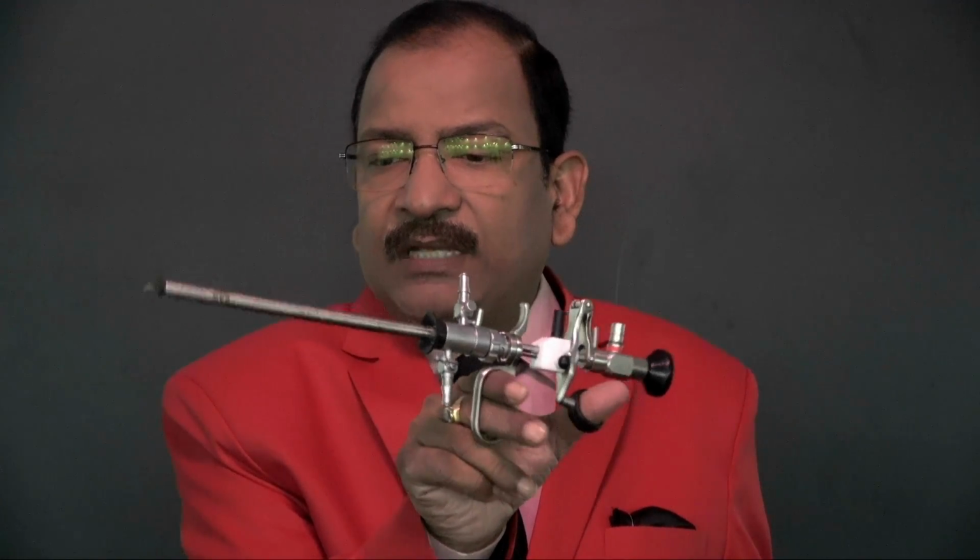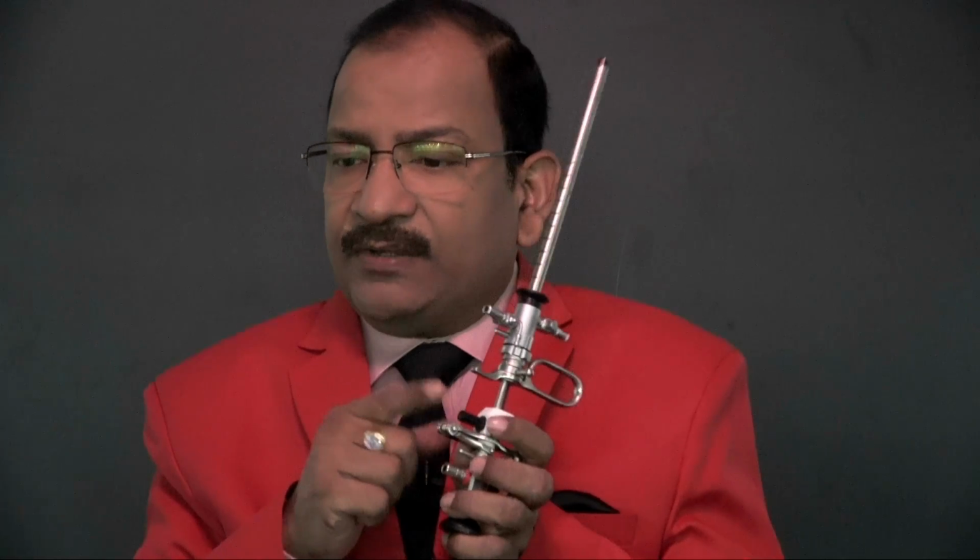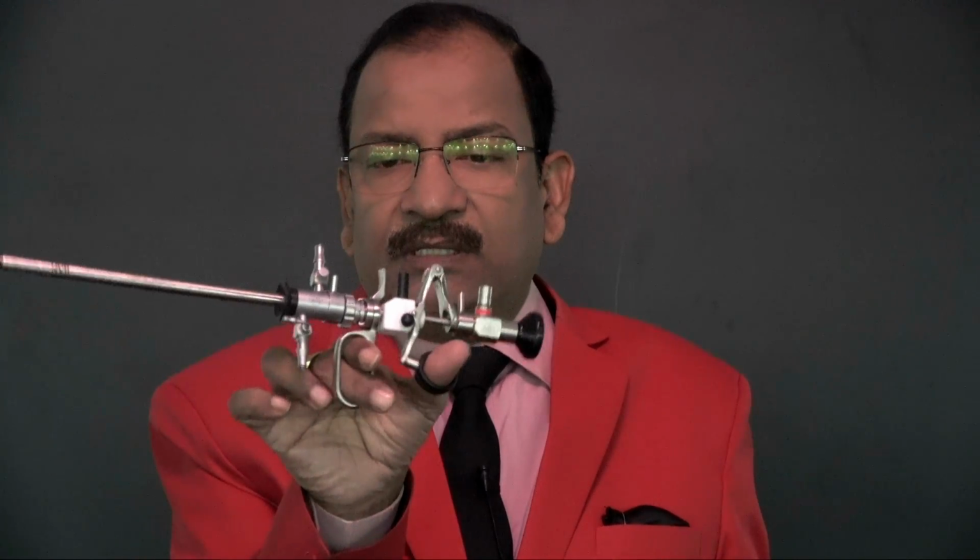See, this electrode is coming in and out, in and out, and you can go and cut, cut, cut, and here you will attach the current. This is for electrosurgery, to attach the electrode. Minimum 80 to 100 watts of current is required here, because you are working underwater. So 30 to 40 watts will not work. You need that minimum wattage. So this is done, and this is called the resectoscope.